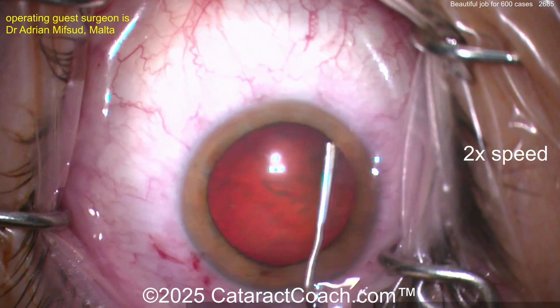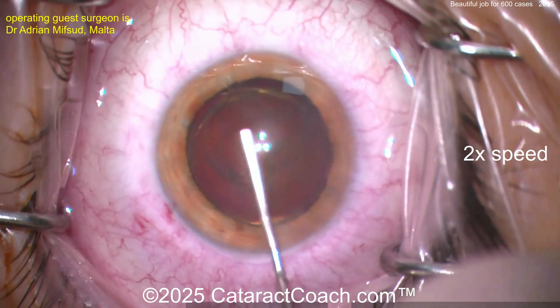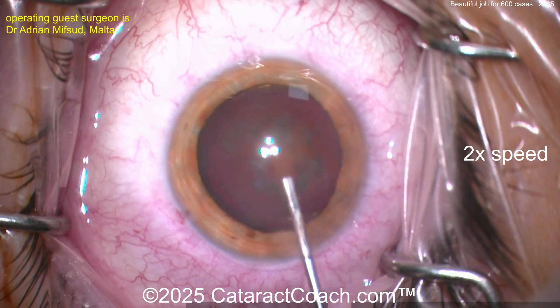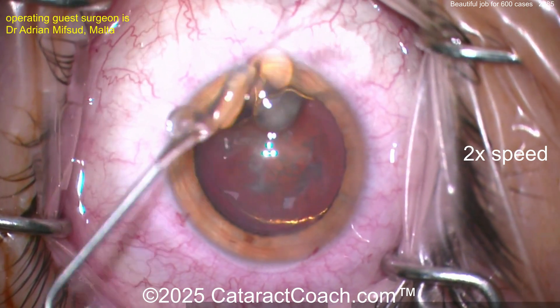Now here comes a cannula to do some hydrodissection — a little bit of gentle hydrodissection there. There's a hydrodelineation of the golden ring. And let's see that nucleus — that's probably going to spin. There it is. You know my saying: if it does not spin, you will not win. That's spinning — you're going to win in this case.